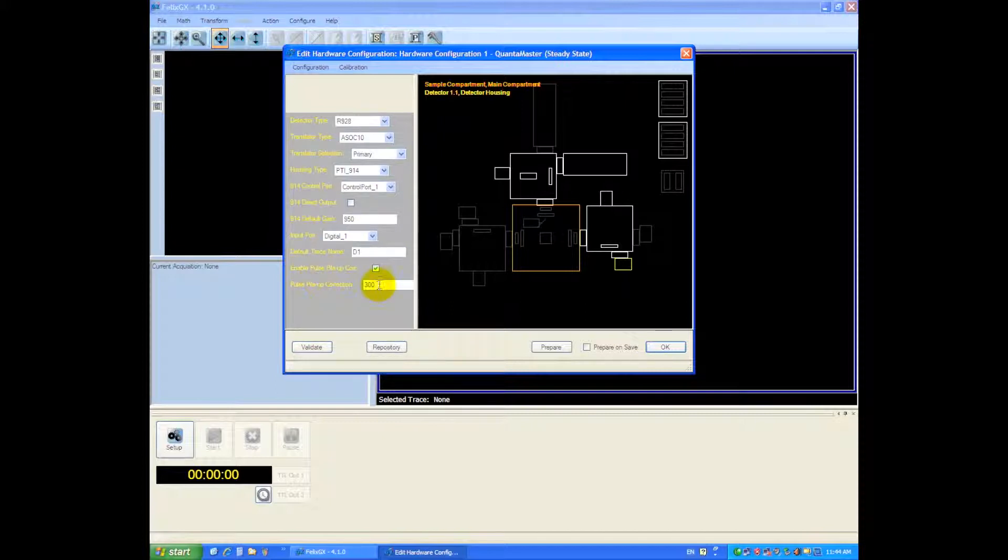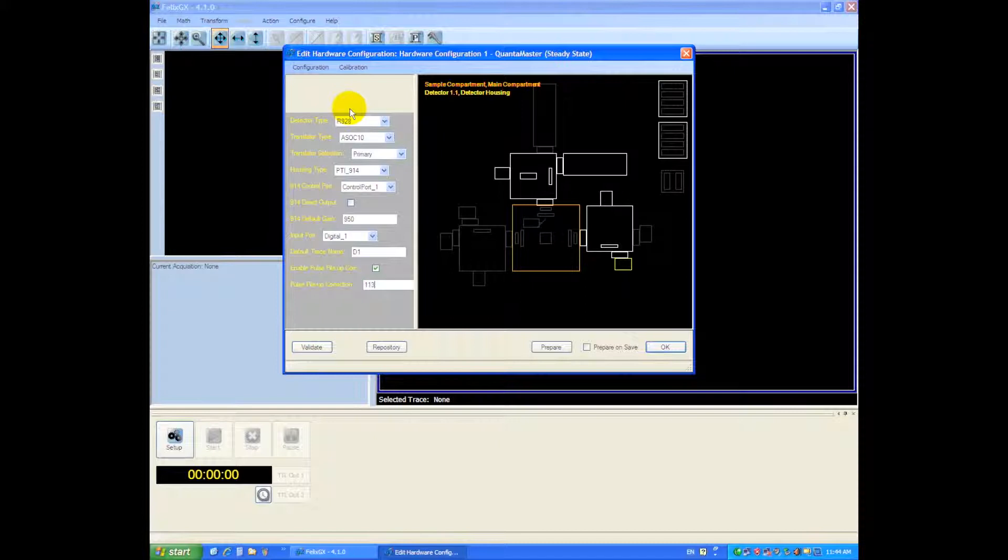We want to change the pulse pile up to 113 for the 914 digital housing. Okay so these are all the settings that are required for the instrument.